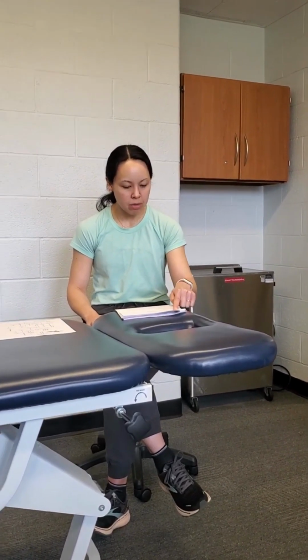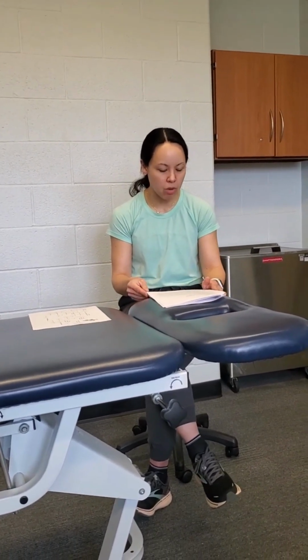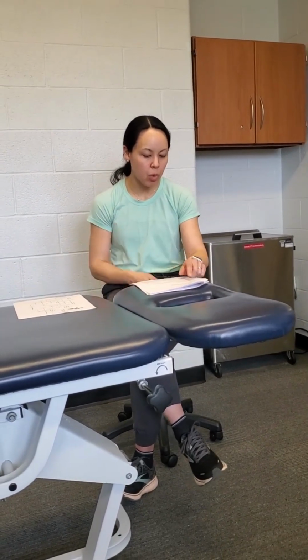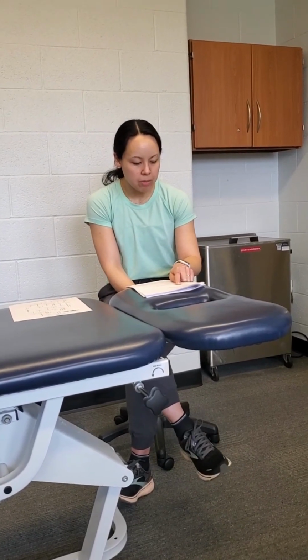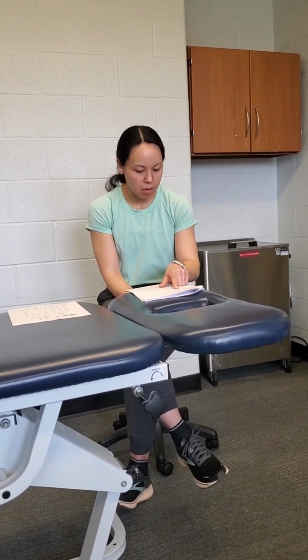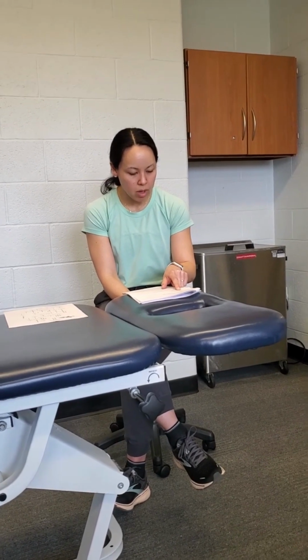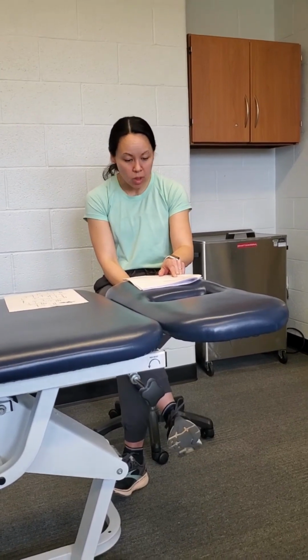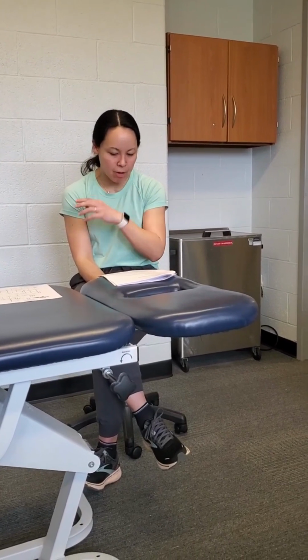And then if we go down to resistance training, that's a little bit more of what we talked about during the course. The load is about 20 to 40% of their 1 RM, and the pressure is about 40 to 80% limb occlusion pressure. So it's the same as the aerobic. And then we've already talked about the parameters. Rest is 30 seconds between sets. Pace is 1 to 2 seconds concentric to eccentric, so it's the same. And frequency is 3 to 4 sessions per week. The goal is to hit the point of fatigue in the final set. We've already talked about that.